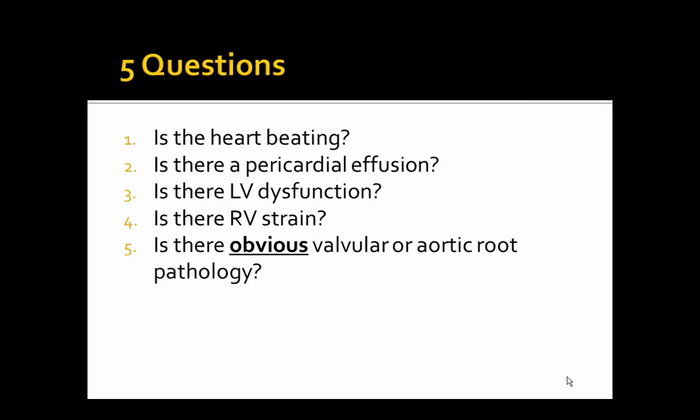So, with that in mind, let's jump right into our topic here, 5 questions. First thing I'm going to do is tell you the 5 questions. You've got a patient with a heart, and you take some pictures of that heart, and we're going to make it simple. Question number 1, is the heart beating? It doesn't get much easier than that. I think my 3-year-old can figure that out on most patients. Then next question, is there a pericardial effusion? And then we'll talk about, even beyond that, signs of tamponade.